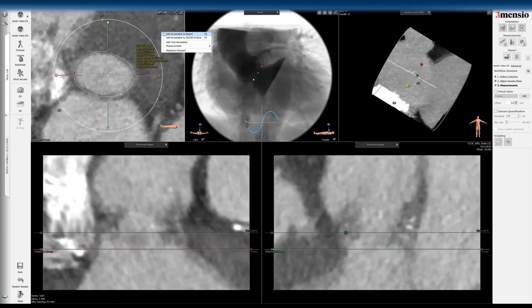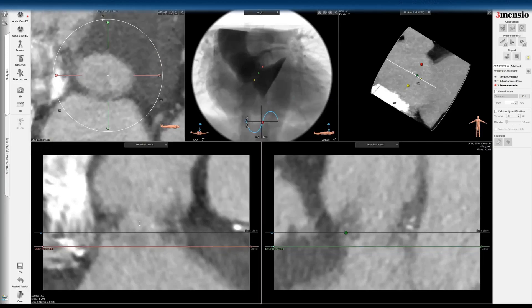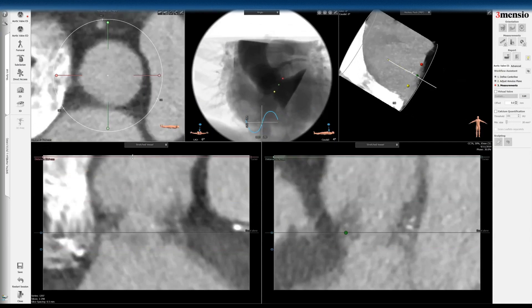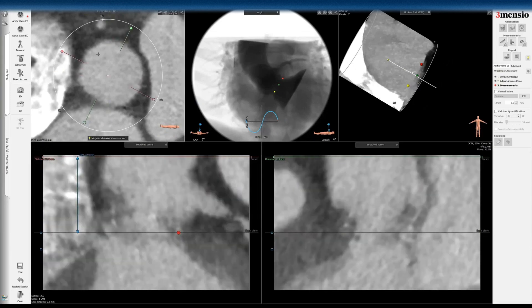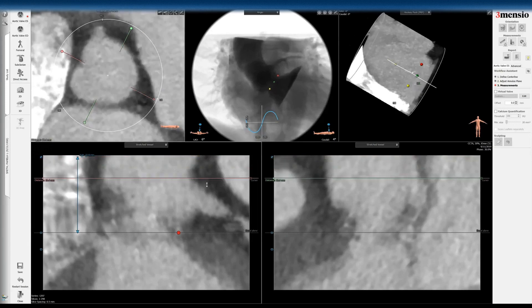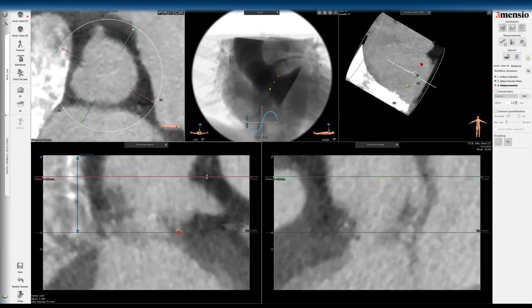You can see that that's the LVOT. And then the STJ — you can see that's the sinuses coming across, so the STJ is roughly there. I'm going to rotate it so you can see the left main takeoff there, and then do your ruler times two. If you need more time to see how I do these labeling and measurements, you can go to one of my other video tutorials to see it done in a slower, more systematic manner.